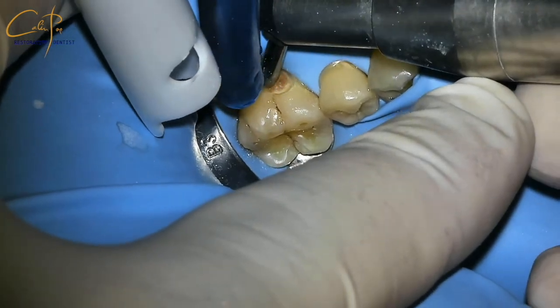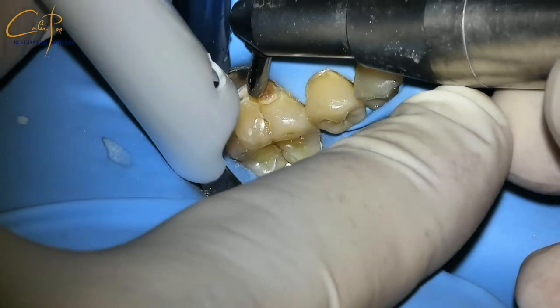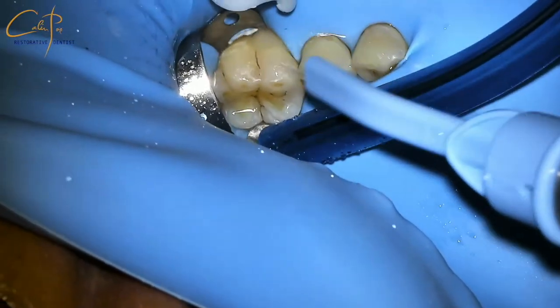Everything is nicely isolated now, so I can carry on with sandblasting and then selective etch. This is such an amazing instrument — look how nicely the adaptation process goes. Try to imagine doing this without rubber dam. Some extra polishing and the case is finished.